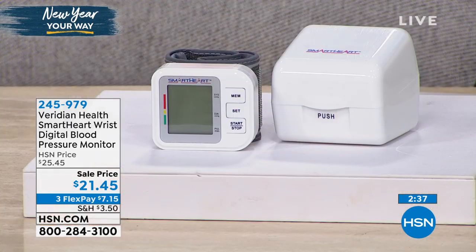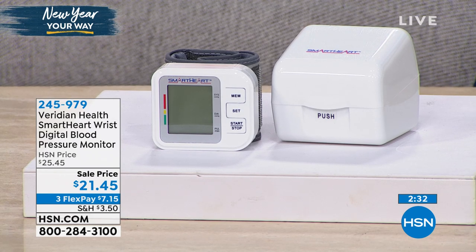It's amazing how we all know what's going on in social media, we know who the latest celebrities are, but we don't know enough about ourselves. So if you're really committing to making those better choices, to doing better, to taking care of yourself this year, this is one of those items that is a must in any home. It is easy to use — this goes right on your wrist, five and three eighths of an inch to eight and a half inches.